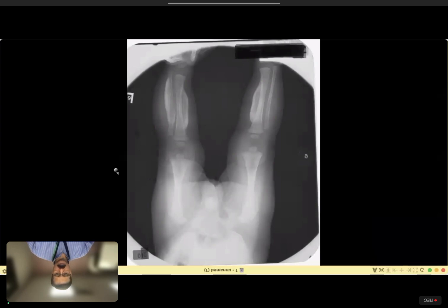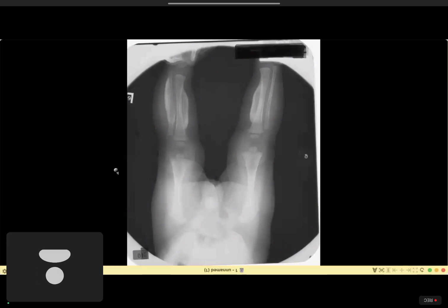Over to you. I'm presented with a frontal radiograph of a child. I cannot see the femoral heads. So I'm assuming that the child is less than 6 months of age. There are abnormal confluent periosteal reactions seen involving both the diaphyses of both tibiae and the left fibula as well. The periosteal reaction is not extended to cover the epiphyses. It's only on the diaphyses. The bone density is maintained. There is no loss of bone density.